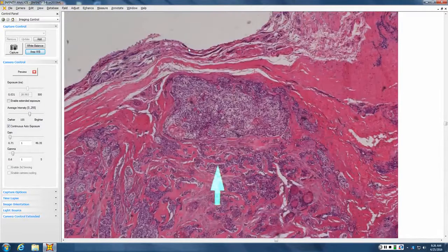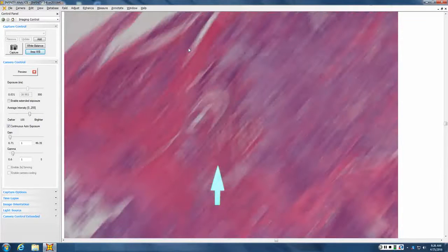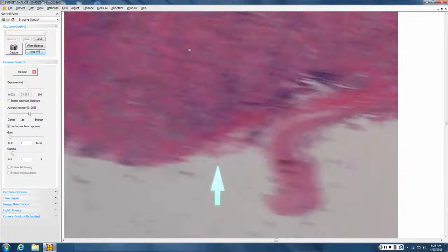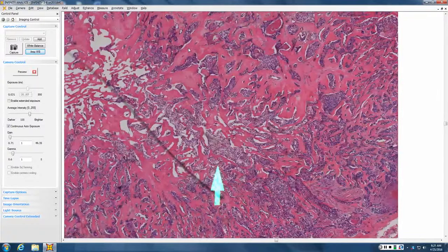Then you're going to look at the periphery. It's a big nodule, but it's not really infiltrative. The whole thing, despite its size, is probably a completely benign poroma because that stroma is throughout, and that stroma suggests chronicity. It takes time to get that million layers of basement membrane zone.